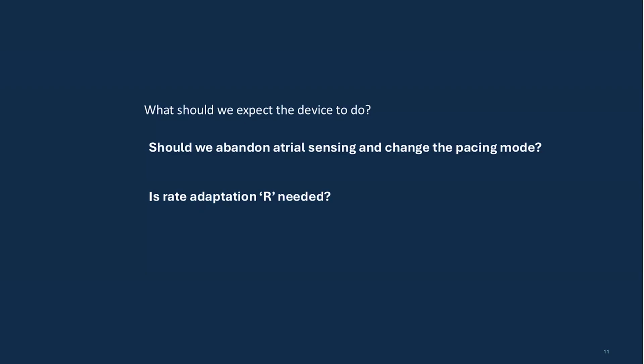I'm also not sure, so maybe Dr. Mohamed can also assist. Yes. In this patient, we should interrogate the pacemaker, okay, and see. Sometimes these fibrillatory waves are not sensed very well in the atrium. But you told us already that there is an automatic mode switch, and it changed the mode to VVIR, okay.